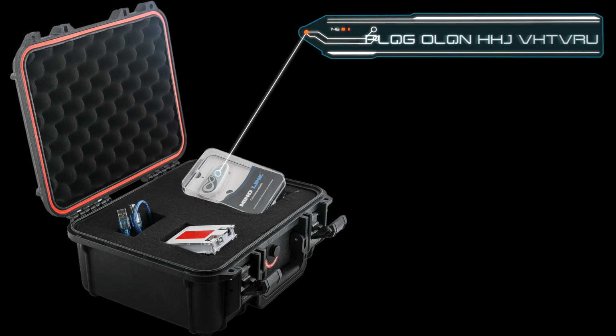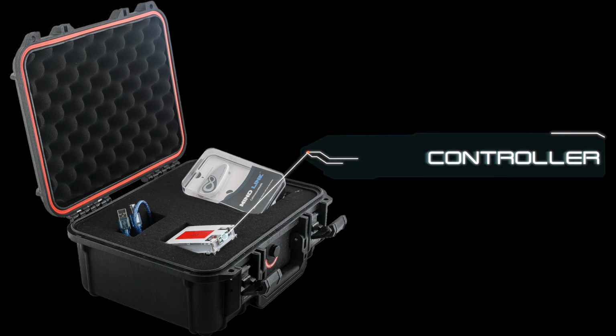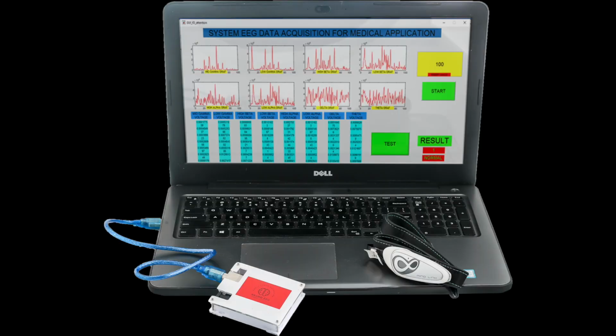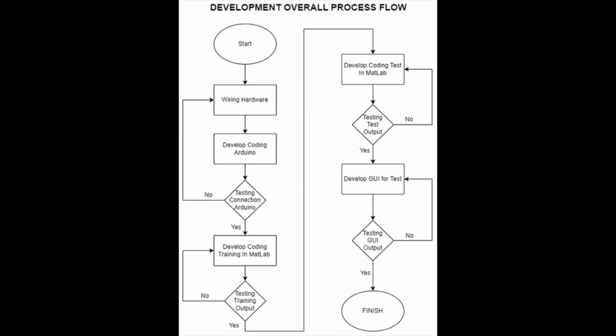Determine which kind of input data should be used to explore epilepsy seizures detection and achieve the best results for use with a neural network. Also to test and compare real brainwave data, obtained from the MindLink EEG sensor by using artificial neural network, ANN, using Bonn University dataset. By using hardware such as MindLink EEG sensor, Bluetooth module and Arduino Uno as a medium to take data from the patient's brain and send it to MATLAB software to analyze and get answers.